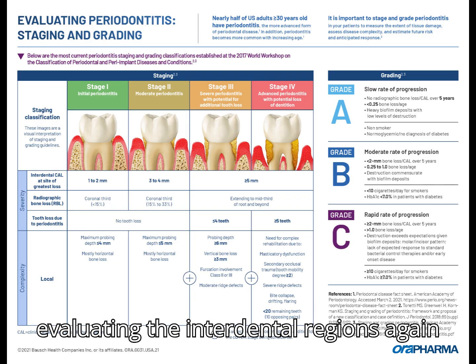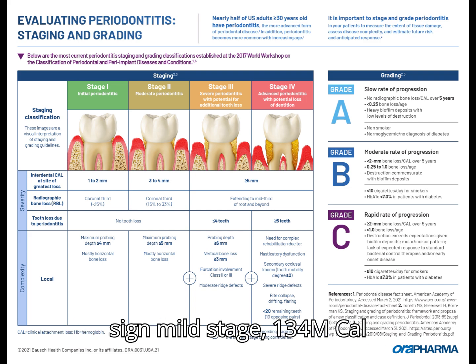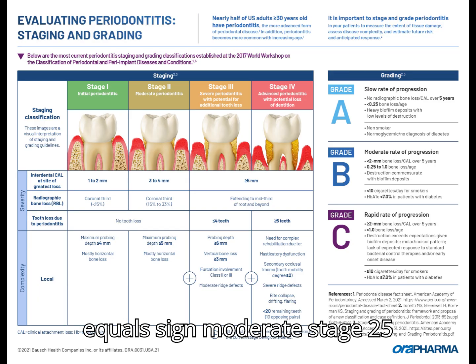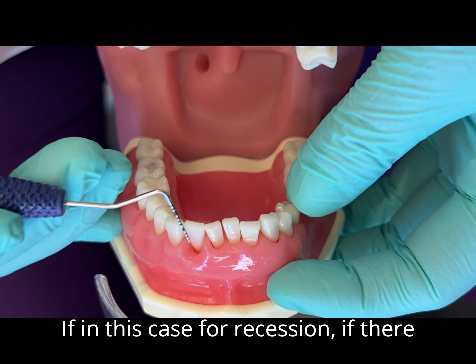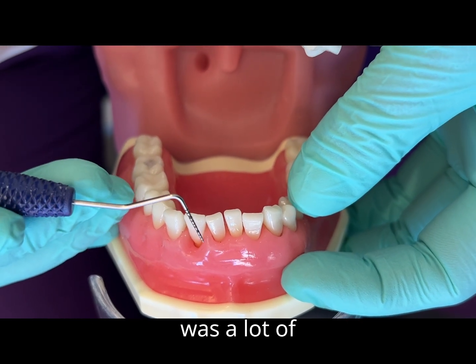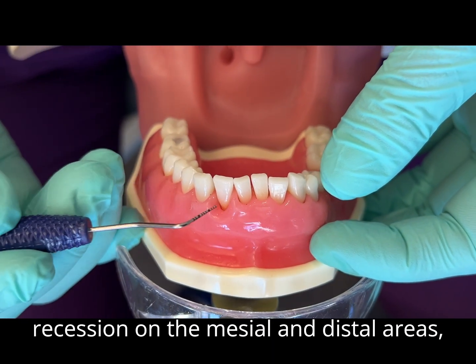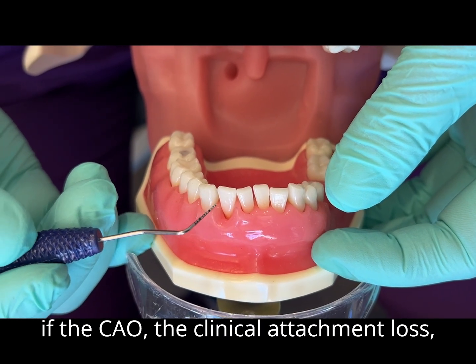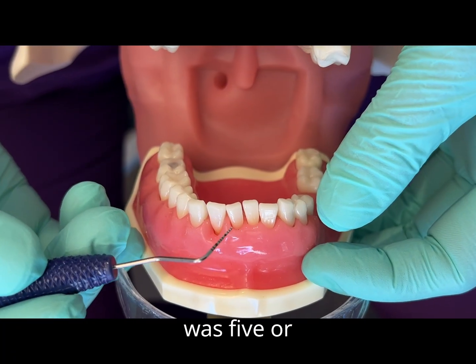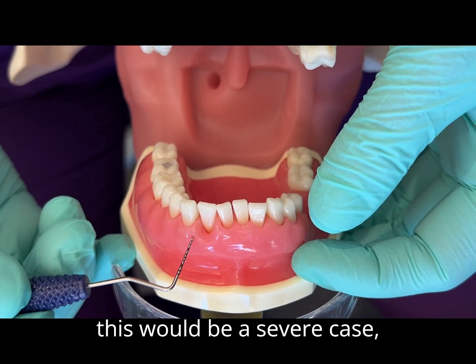When evaluating the interdental regions again for classification, 1-2 mm CAL equals mild, stage 1, 3-4 mm CAL equals moderate, stage 2, 5 mm CAL or more equals severe, stages 3-4 advanced. In this case for recession, if there was a lot of recession on the mesial and distal areas, let's say the clinical attachment loss was 5 or above millimeters on the interdental, this would be a severe case.